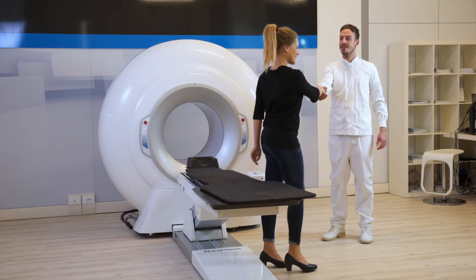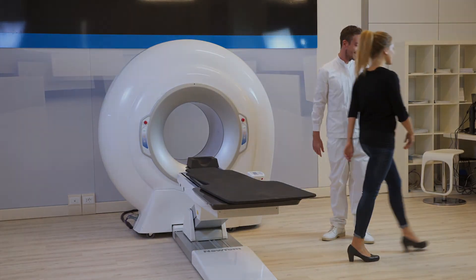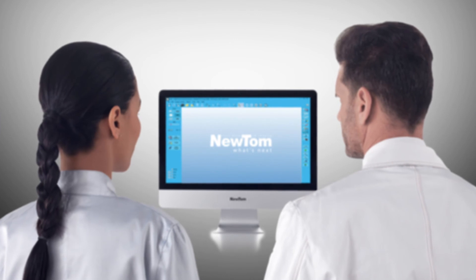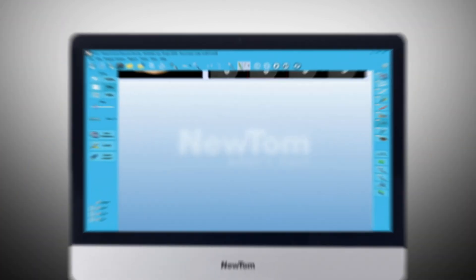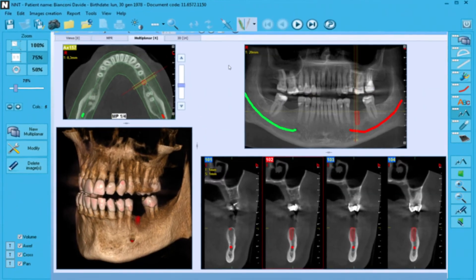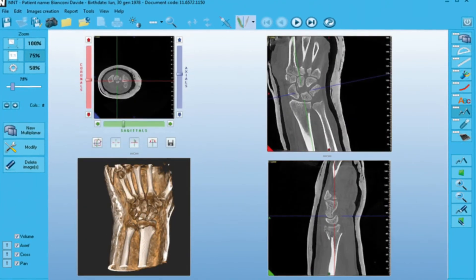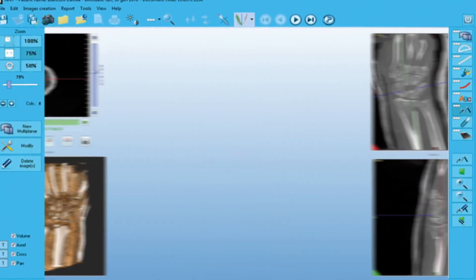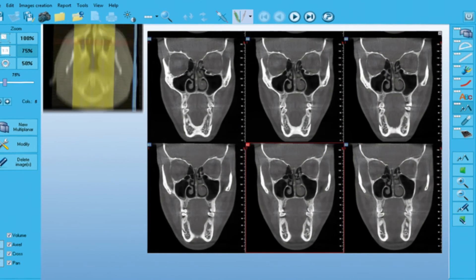At the end of the examination, the patient can leave the room. The 5G XL extends CBCT technology into multiple fields of application.